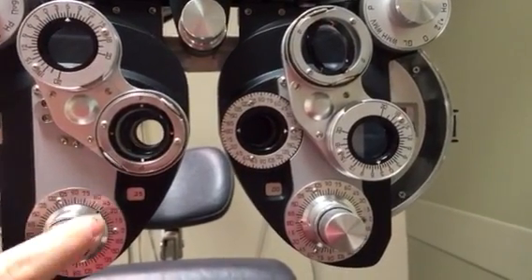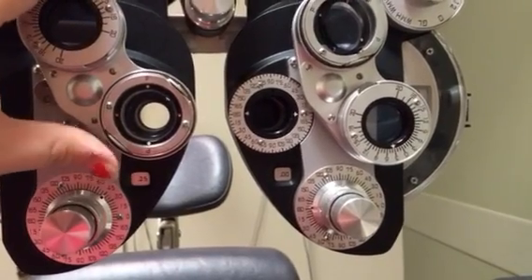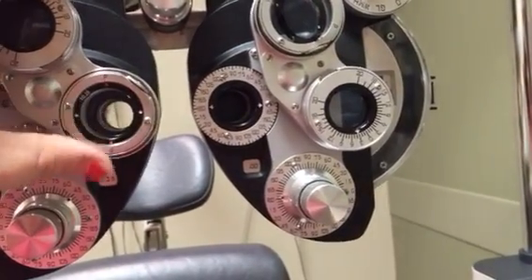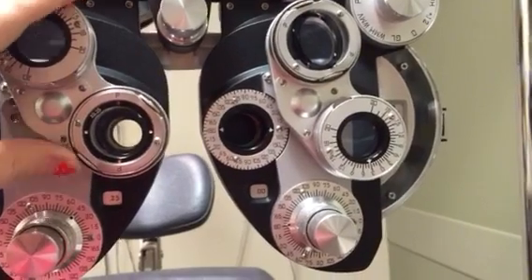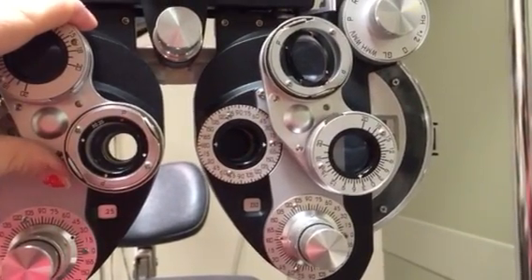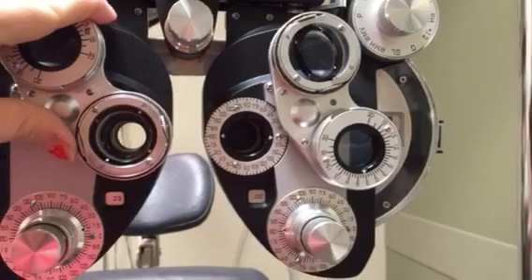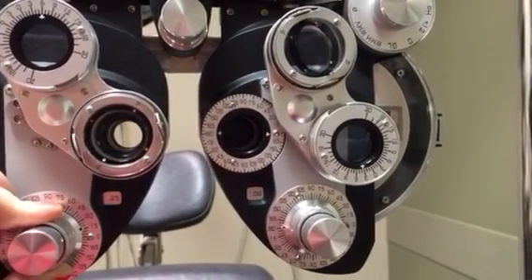Adjust the knob so it lines up with 45 degrees. Looking at the dial, the 45-degree marker tells us whether to go toward 60 or toward 30. If the patient prefers two, we're chasing the white and moving toward 30 degrees. Keep adjusting — if they then prefer one, you've passed the axis. Go back in five-degree increments. Move to 20 degrees if needed, continuing in small steps.